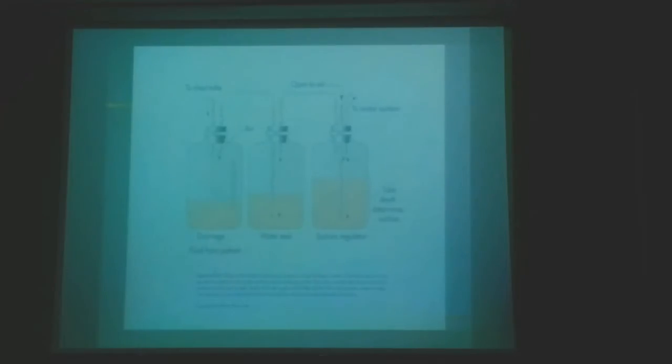The air cannot enter again because there is water. It resists the air. So this is the underwater seal. It's like a one-way valve. It allows air and pus or blood to come out and prevents air from going inside. This is the underwater seal. The air comes out easily from here as bubbles, and when the air tries to go inside the patient, it is resisted by water.